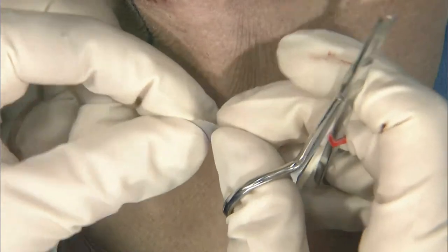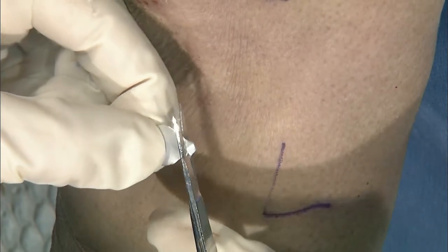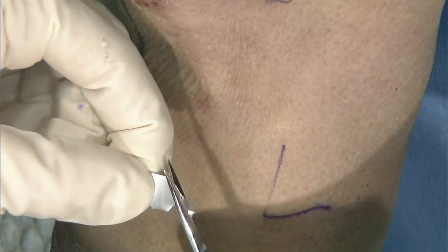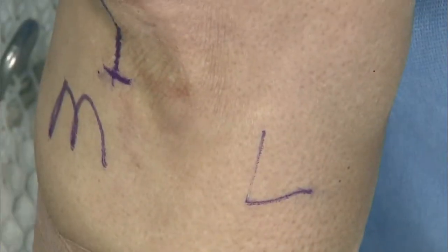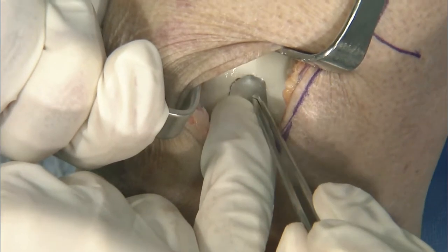Yeah, I guess like a hybrid of what you do. So I put the foil close, then I do a rough cut of a rectangle, essentially. Then I press that in, and I find that it's just easier to manage in the joint. And then from there, I start to cut around just like what you're doing. Definitely want to keep it smaller. There's a couple problems with it coming up the edge, but one of them is that it adds to the volume closer to the edge, and the fibrin, I think, will also sit higher.